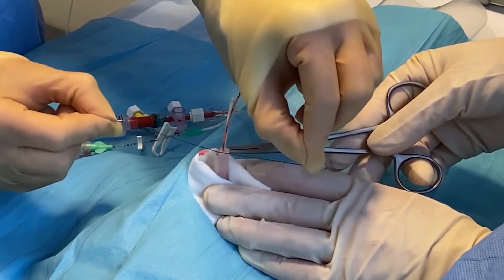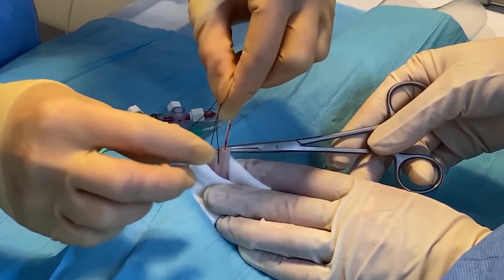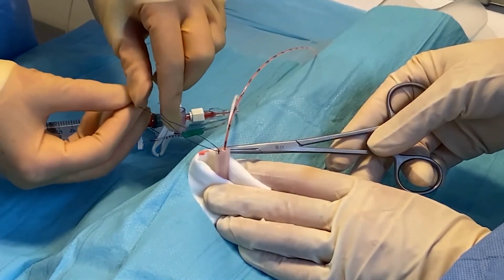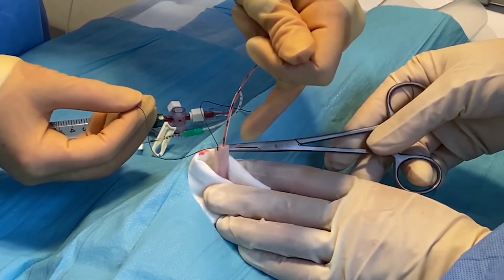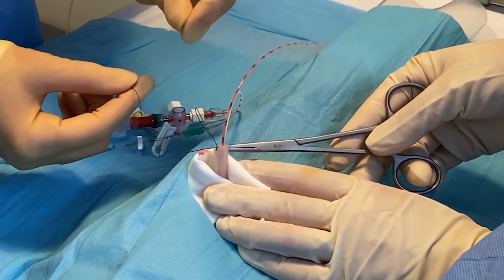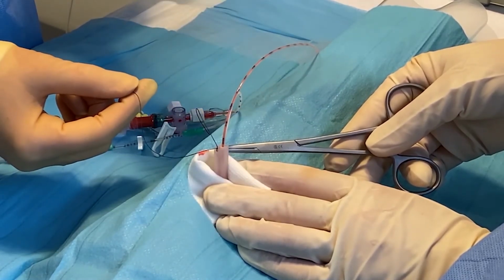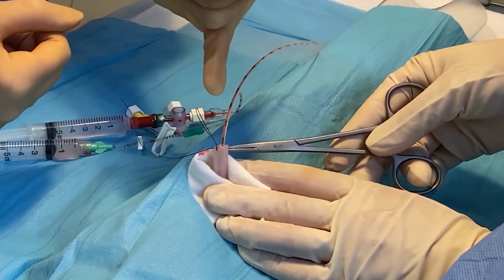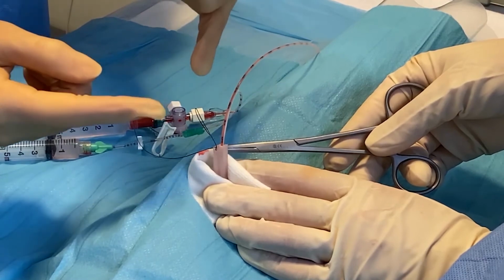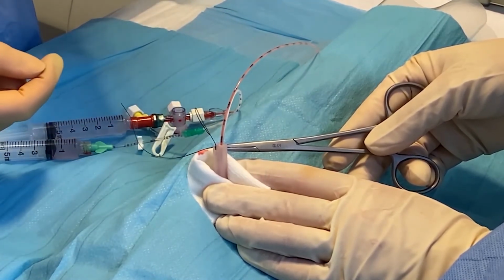So I do at least 2, if not 3 knots to make sure it's really secure. Okay. You then will need to do exactly the same on the other side of the catheter. And once you've done that, for additional security, you can tie around the catheter itself. If you have a UAC and a UVC in situ, you will need 2 ties for each catheter, so in total you would have 4 sutures.